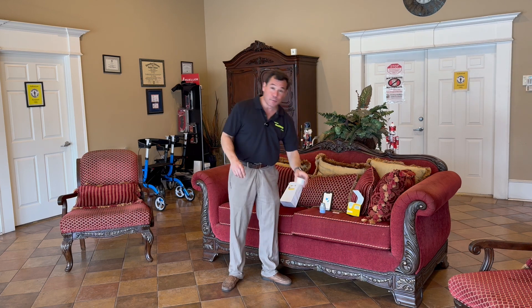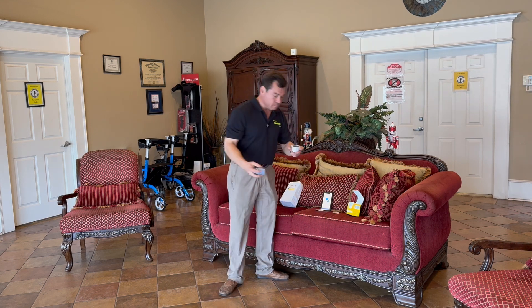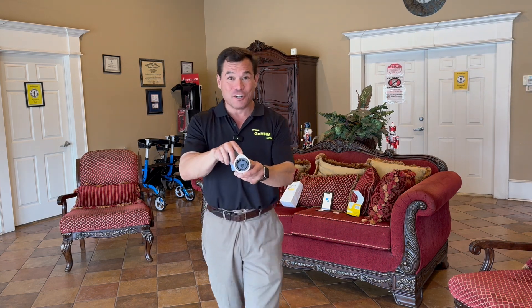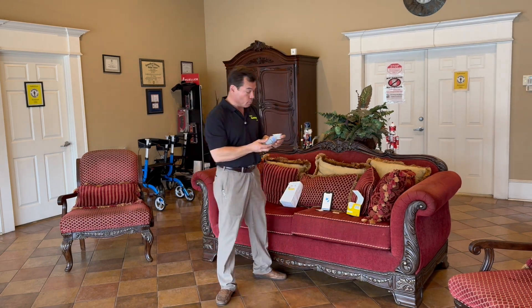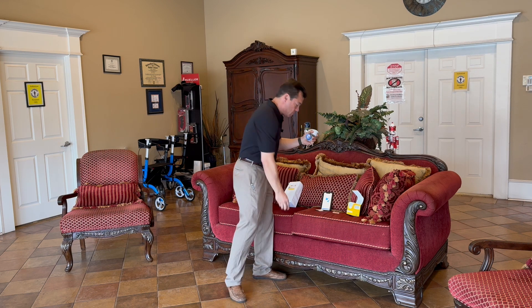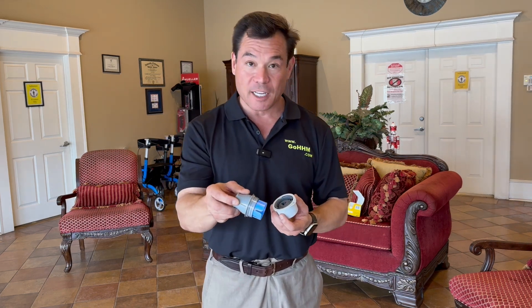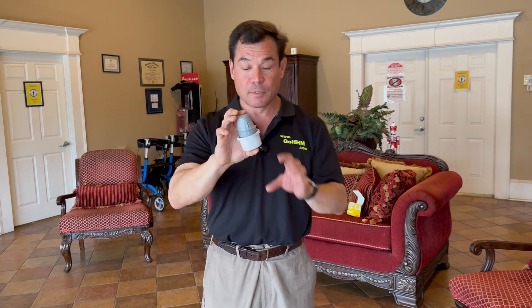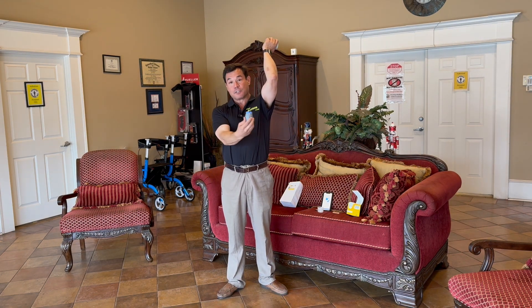Now that we've prepped our arm, we're going to open the sensor packaging. As you can see, there is a small black line on the sensor packaging. Next, we open the applicator itself. On the applicator there is also a line, and we're going to take that, put it in, and match up the two lines. Push it in, pull it out, and our sensor is ready to go.